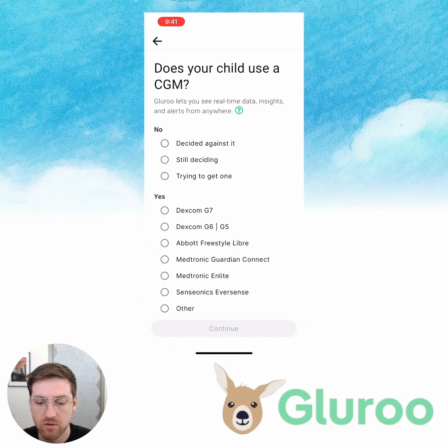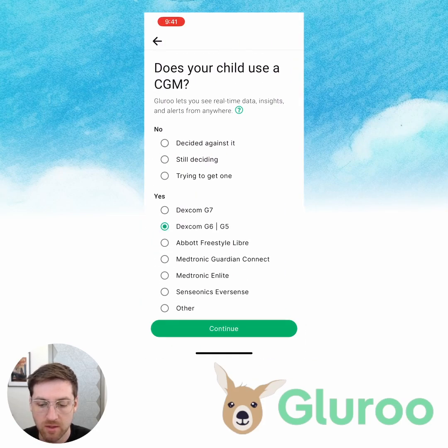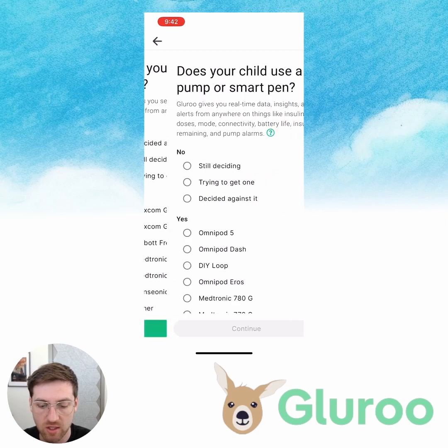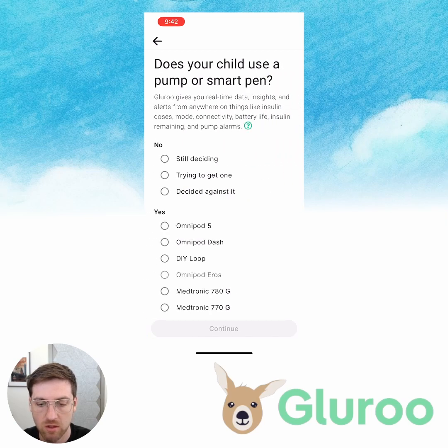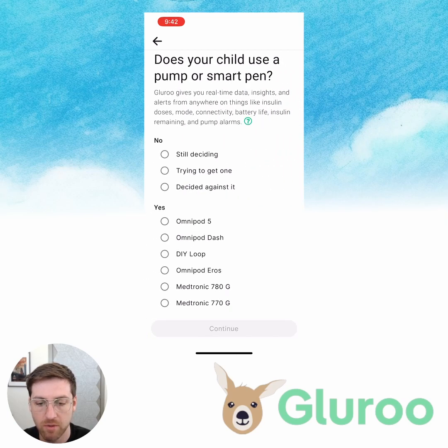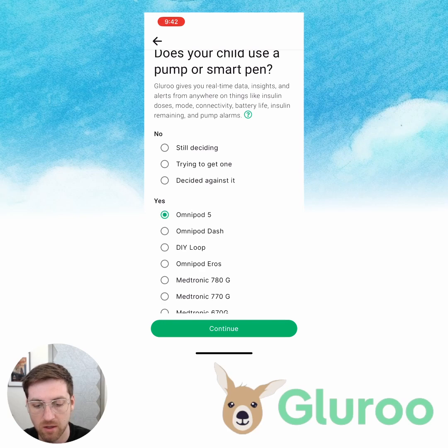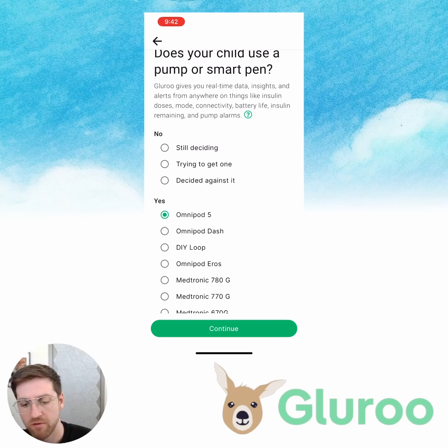Does your child use a CGM? Yes, they're on the G6. And how about a pump or a smart pen? I'm going to say that Billy uses an Omnipod 5 as well.